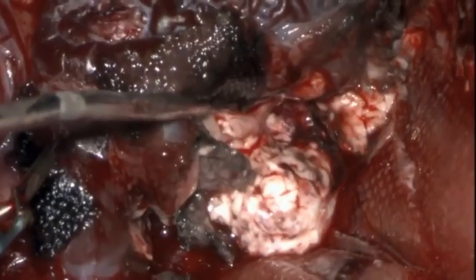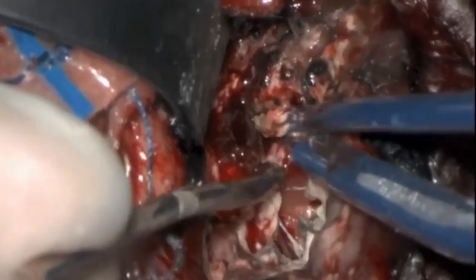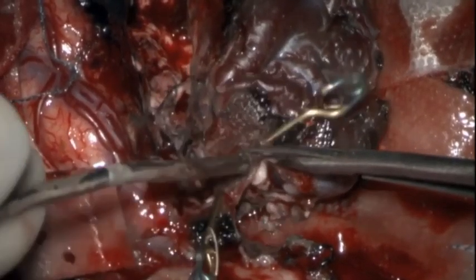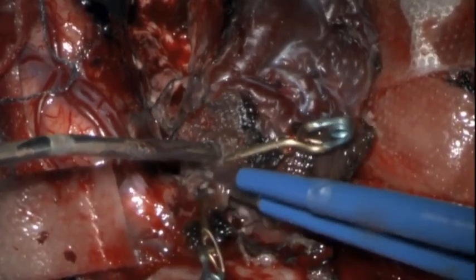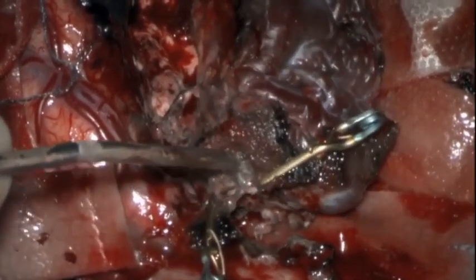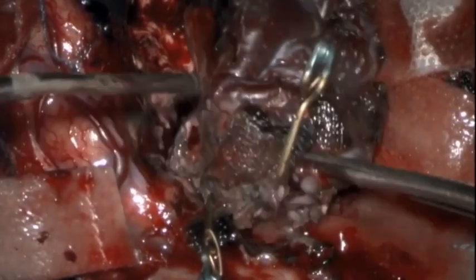As the march continues across the AVM, deeper dissection can be performed until the last feeding artery is taken. Deep ependymal vessels may be very friable and may need special attention to obtain hemostasis. The dissection is continued until all margins are free from any attachments. This signifies nearly the end of the AVM resection.